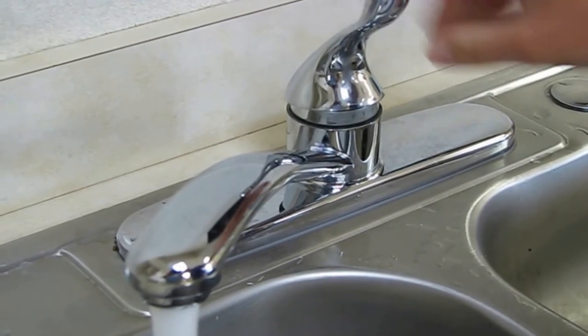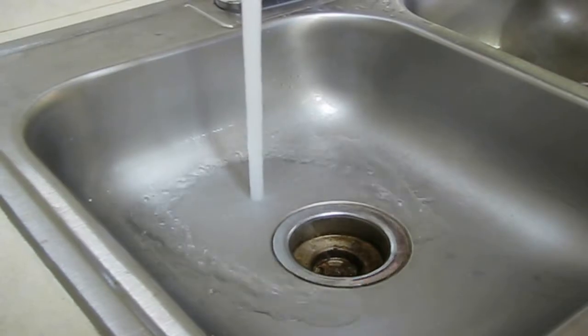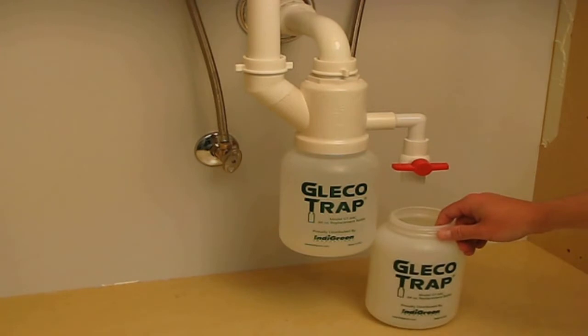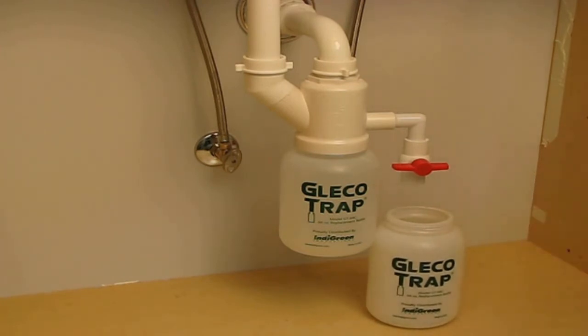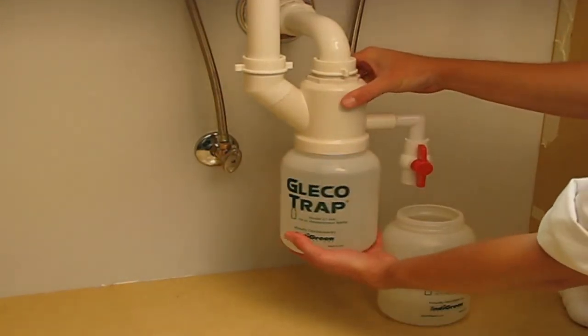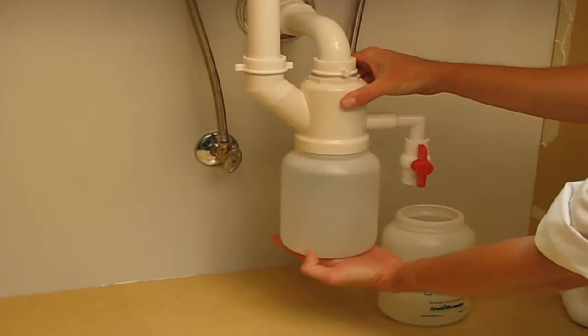In fact, we recommend you don't use these products as they may actually cause a leak. Finally, turn on your faucet and fill up your trap with water. Now you're ready to go — it's just that simple. When it's time for maintenance, simply place an empty Glico Trap replacement bottle under the drainage spout. Turn the red handle counterclockwise and bleed the water out of the drainage lines. Once the water is bled off, carefully unscrew the old bottle and cap it off with the lid provided.